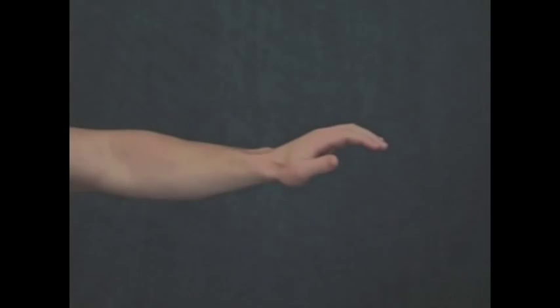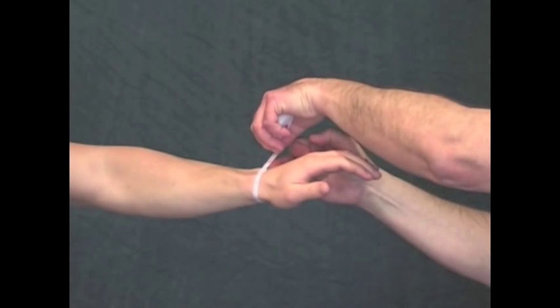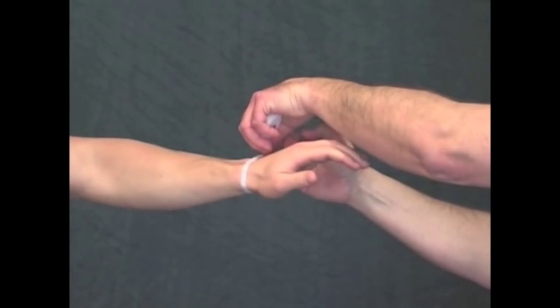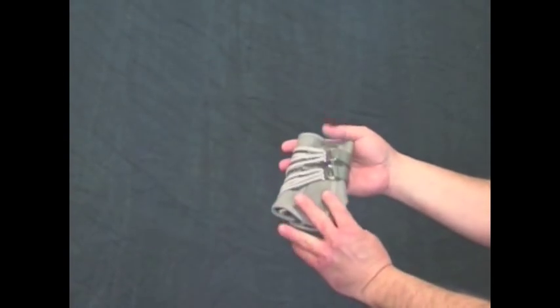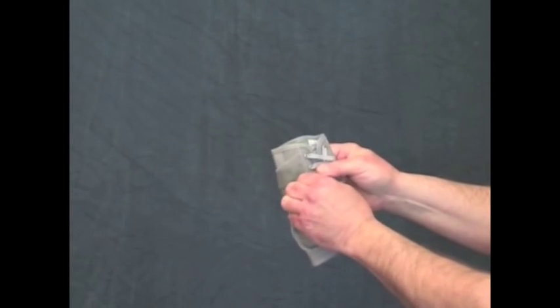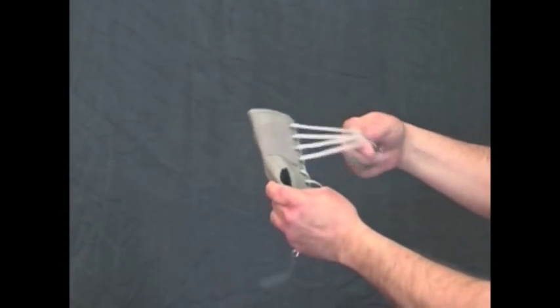With the palm facing downward, measure around the break of the wrist. Check the measurement against the size chart shown on the back of the product carton. After removing the product from the carton, release the two closure straps, allowing them to dangle, and then loosen the lacing arrangement to its fullest extent.